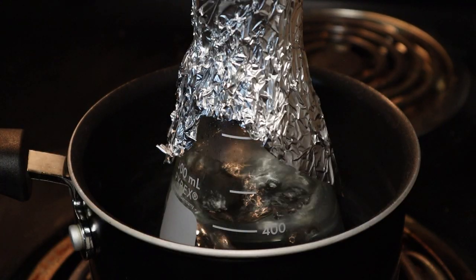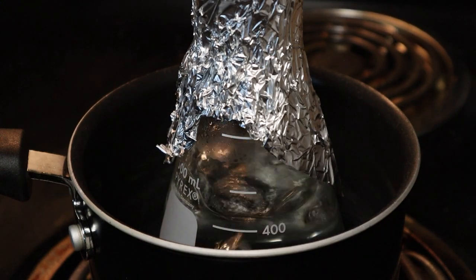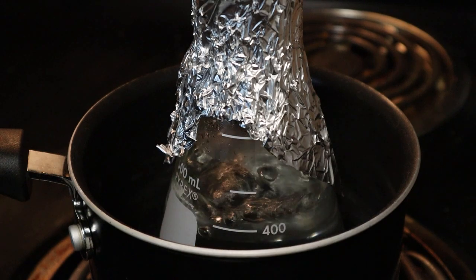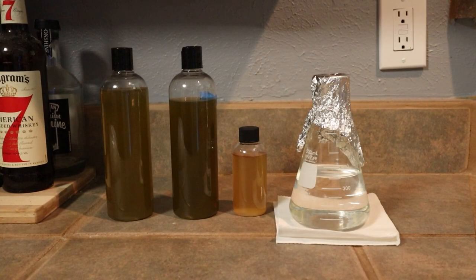Now that the water has started boiling, I just set a timer for five minutes on my phone, and once that's up I'll cut off the stove and the water will be sterilized. Now that our water has cooled down to room temperature, we can go ahead and add the algae to the water.